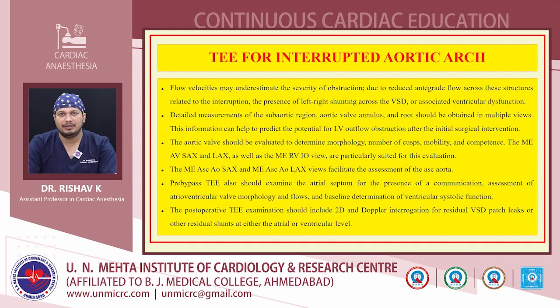The aortic valve should be evaluated to determine the morphology, number of cusps, mobility and competence. The mid-esophageal aortic valve short axis and long axis, as well as the mid-esophageal right ventricular inflow-outflow view, are particularly suited for this evaluation. The mid-esophageal ascending aortic short axis and long axis views facilitate the assessment of the ascending aorta. Pre-bypass transesophageal echocardiography should also examine the atrial septum for the presence of communication, assessment of atrioventricular valve morphology and flows, and baseline determination of ventricular systolic function.